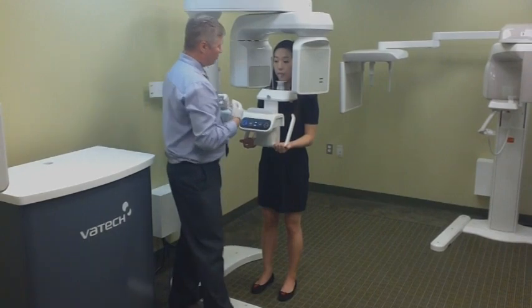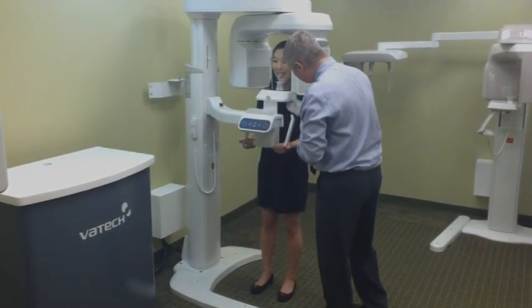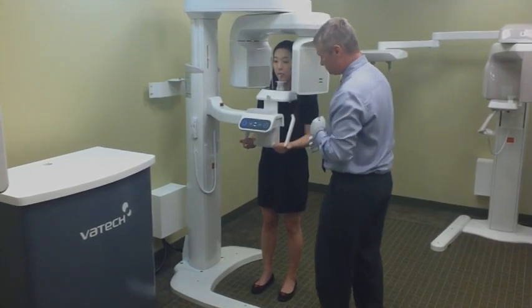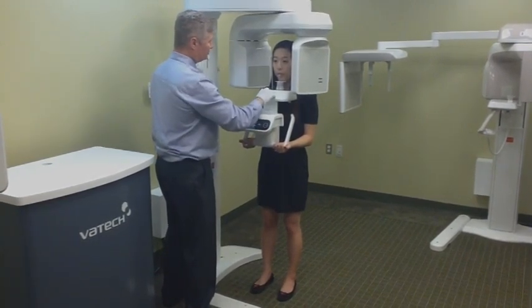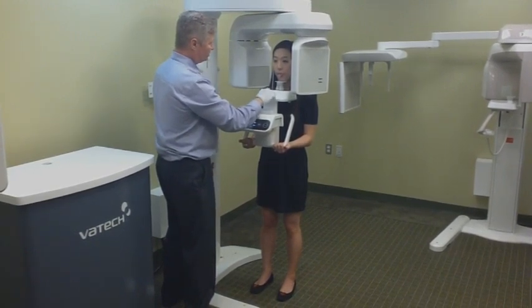So what I need you to do for me here, go ahead and smile, and I'm going to adjust this here to the center of our canine tooth. At that position, go ahead and relax your lips again. The last thing I'm going to do now here is close the temple rods. So with that tightness here, you can feel some pressure on the side of your head. Okay? So it shouldn't hurt, but you may feel slight pressure on the side here.